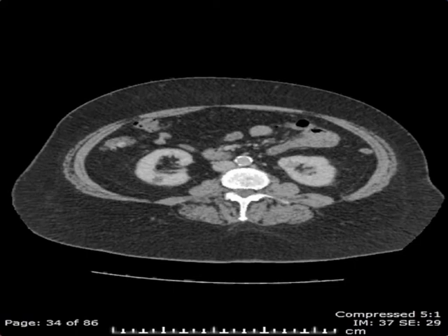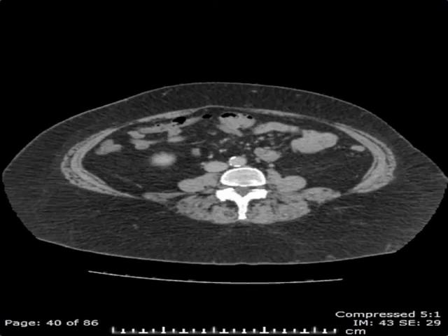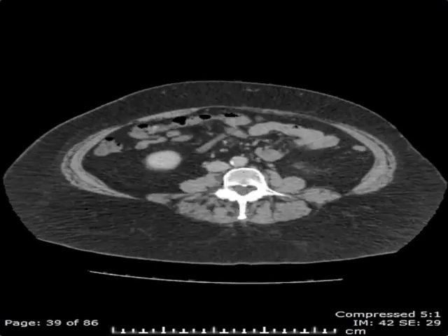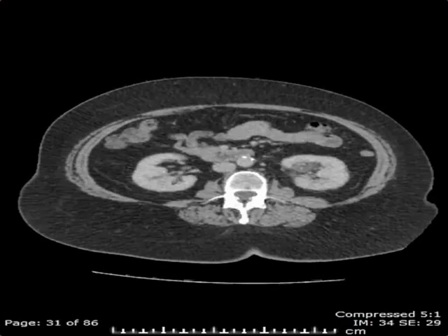As we scroll through the right kidney, we can see that in the interpolar to lower pole region there's another simple cyst. However, there are no solid masses arising from the right kidney to suggest a renal neoplasm.